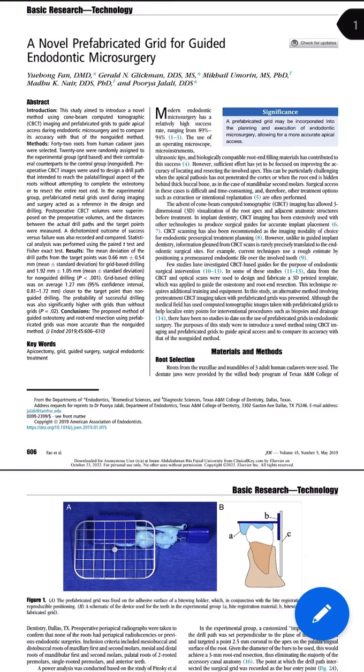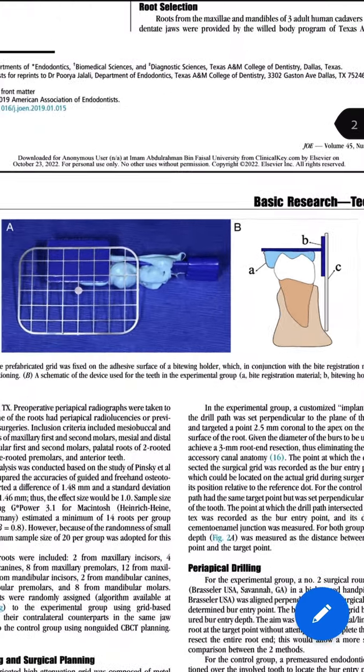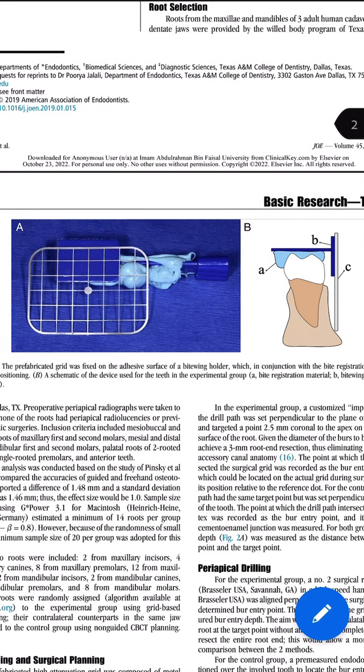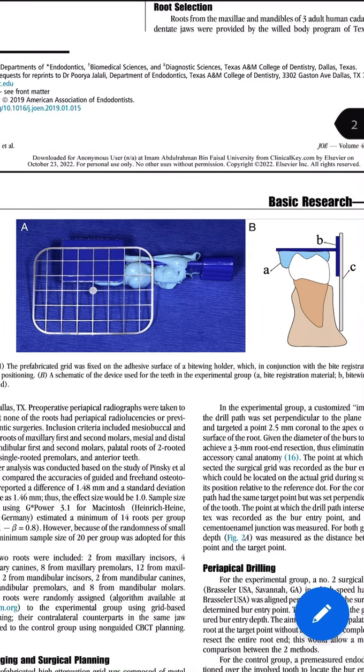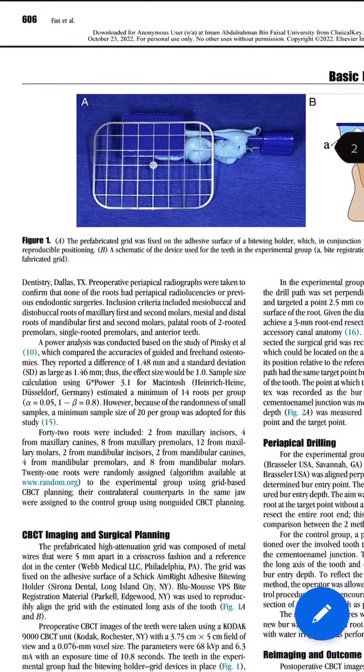As shown in the diagram, figure 1, it's a metallic type of grid affixed to the bite wing tab that the patient can bite on with bite registration material in order to have a reproducible positioning system. This is used with the preoperative CBCT and utilized to locate the point of entry. This technique has been used in the medical field as an aid to localize entry points for interventional procedures such as biopsies and drainage.